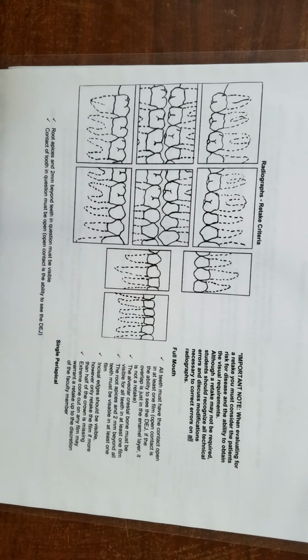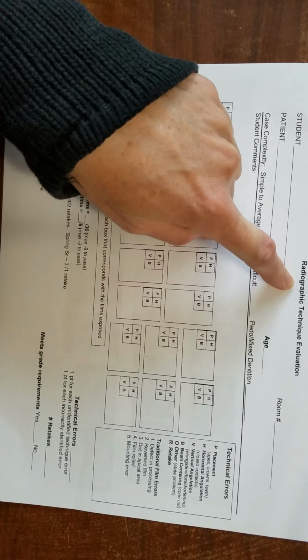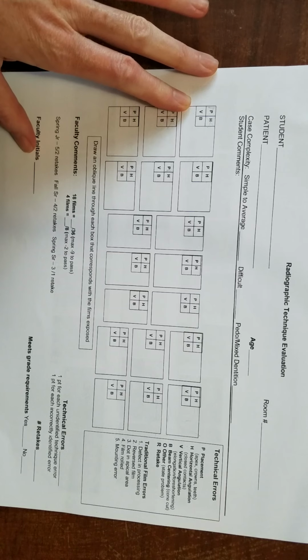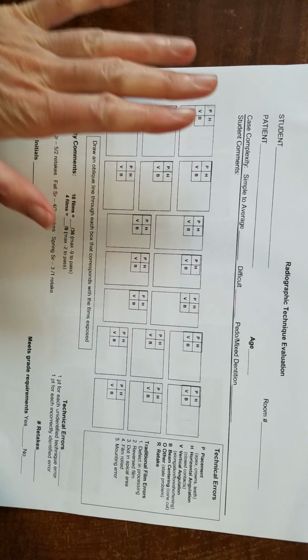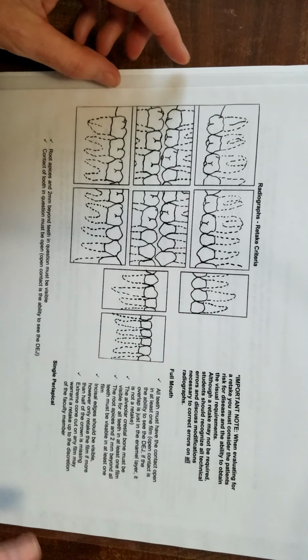Hi, okay, I wanted to show you guys the critiquing form, the radiograph technique evaluation form that you're going to be using when you critique all your films. You'll use this all this semester, all the rest of the next three, well, more than that, the whole 2 years that you are with us. This form gets used a lot. Anytime you take films, you critique them using this form in radiology. So I wanted to explain it and then talk about the retake criteria.